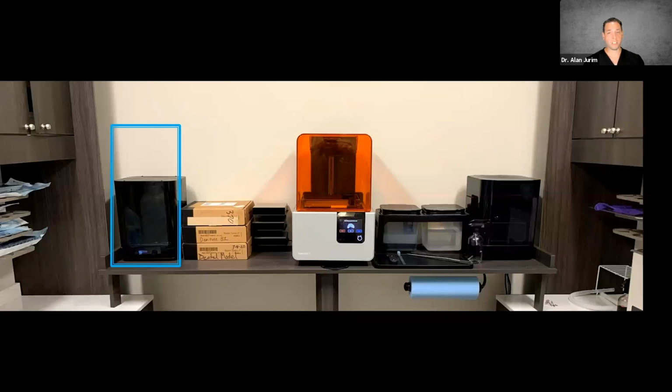Another really, really key thing that I've set up here, that I've learned about, is to make sure you have paper towels next to you and some rubbing alcohol in a spray bottle. This allows us to have everything ready to go. You'll be surprised at how often you have gloves on and you're working with a resin material and you realize you need a paper towel. These are some of the really key things to make sure that the printing process is effective.